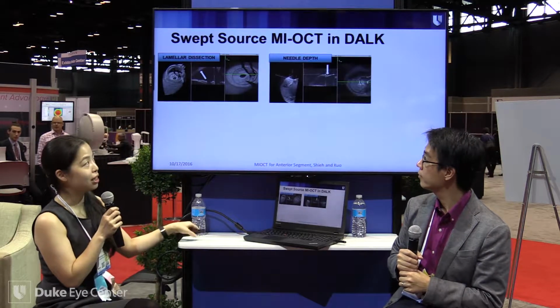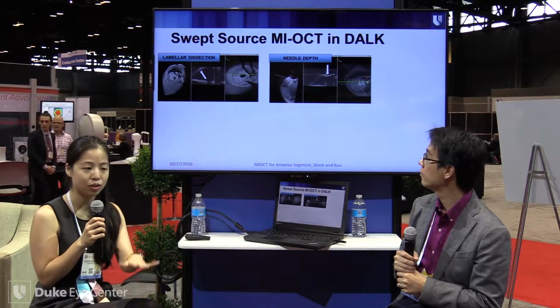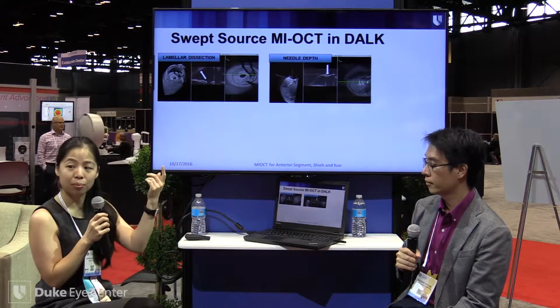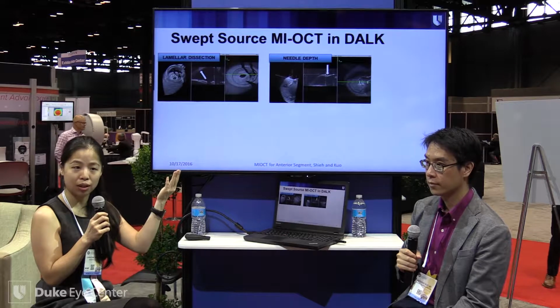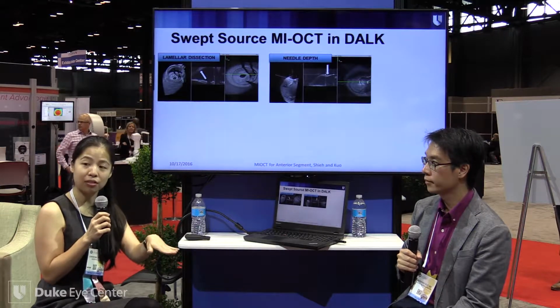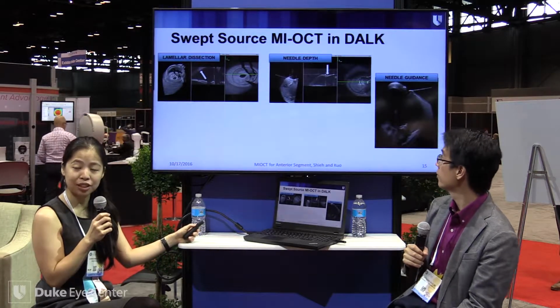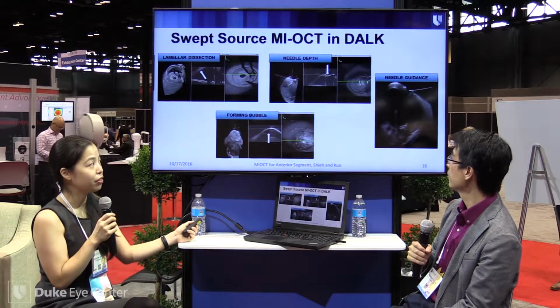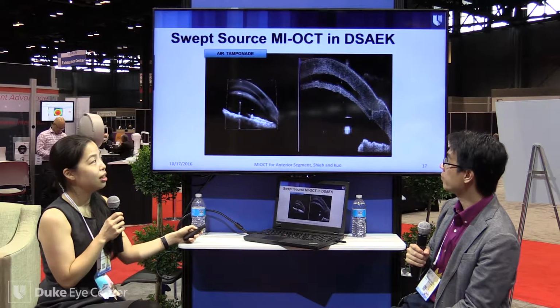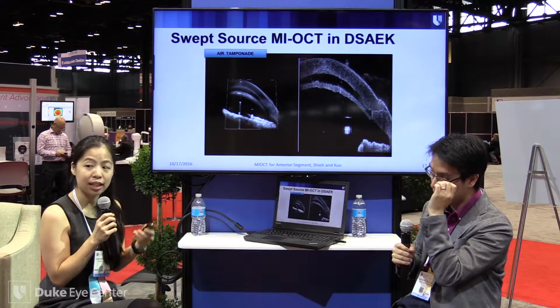Furthermore, in the big bubble technique, you can imagine when you're putting a needle through something that's clear on clear with a top-down view, it's hard to tell exactly how deep you are. So with MI-OCT, we can actually follow the progress of the needle as it tracks through the cornea, such that we're deep enough to create a successful big bubble, but not too deep that we perforate through that Descemet's membrane. OCT also permits needle guidance, and also one can even visualize the formation of the big bubble with the use of OCT.